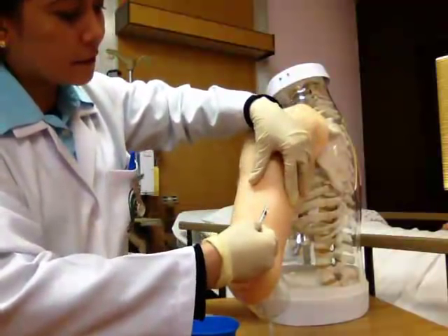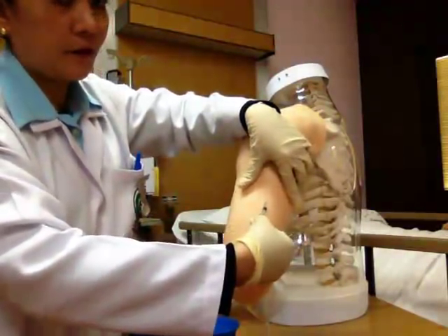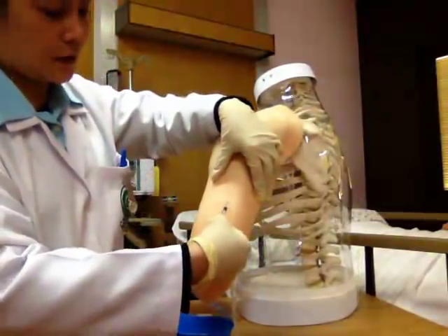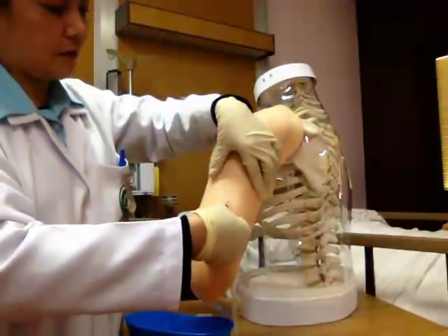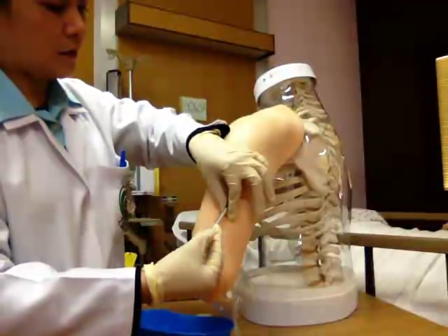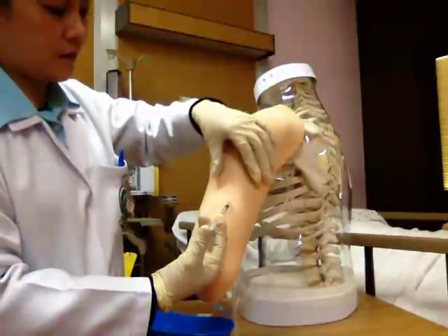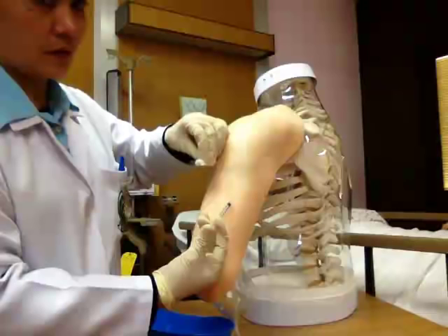Okay, slightly pinch the patient's arm, and at a 45 degree angle, as you can see here, inject the medication. Slightly or gently aspirate also, and slowly give the medication to your patient.